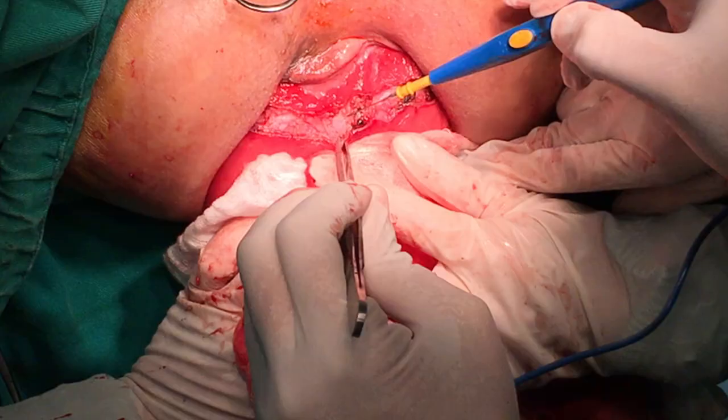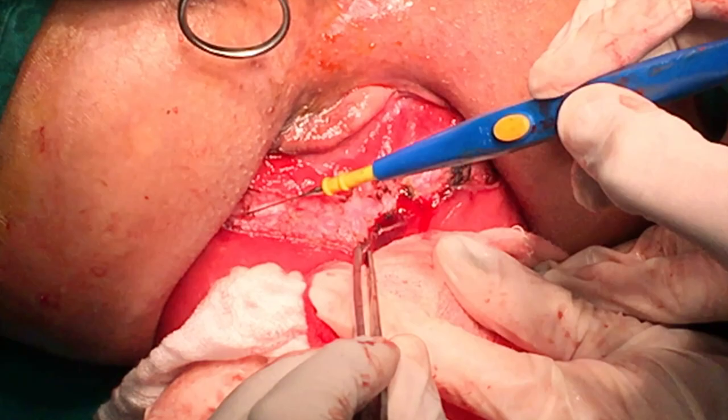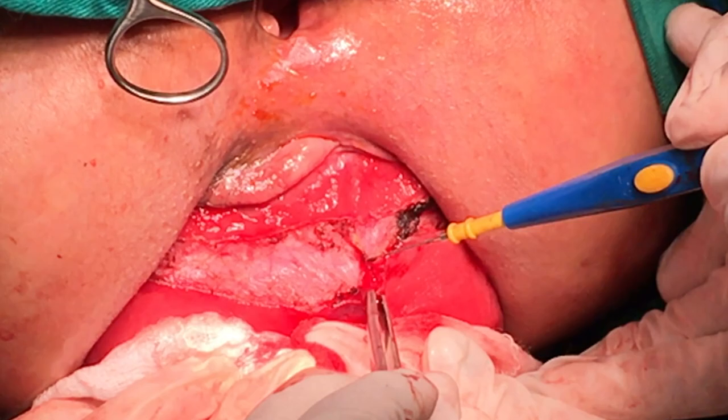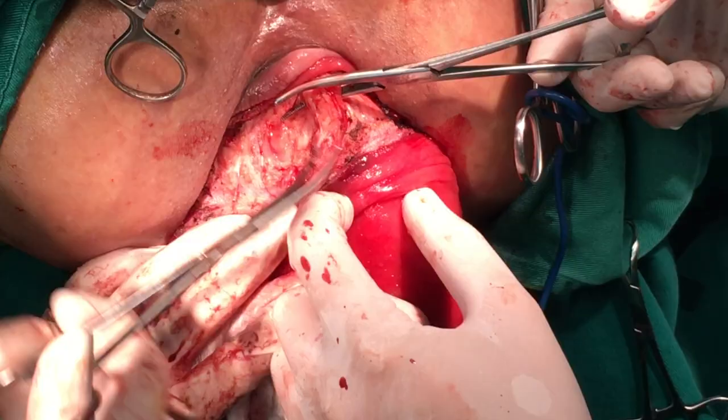A circular incision is made 2 cm proximal to the dentate line in the viable rectal mucosa. The cut begins in the anterior phase of the prolapse with electrocautery equipment. The incision is deepened through the full thickness of the rectal wall.